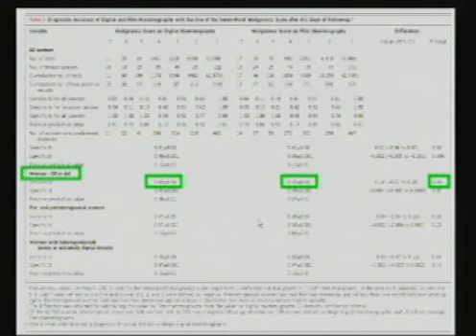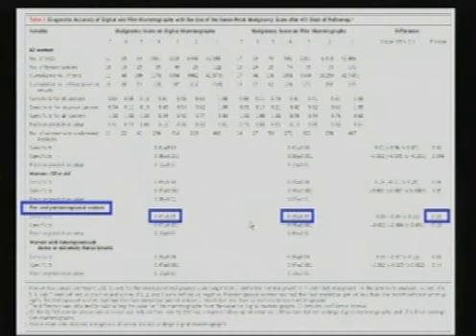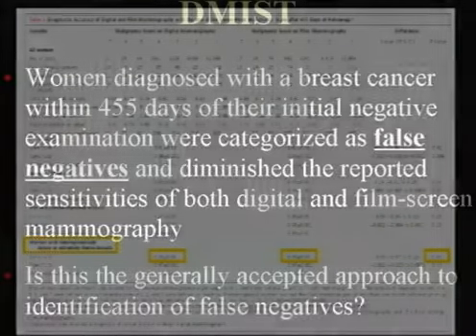That's interesting. Women less than 50 years old: again, some differences, but they are not statistically significant. Pre and perimenopausal women, some differences, not statistically significant. Similarly, women with dense or heterogeneously dense breast tissue, not statistically significant. So why is the ROC curve different? Because it's attempting to incorporate both the sensitivity and the specificity to look at the exam using that 7-point scale.